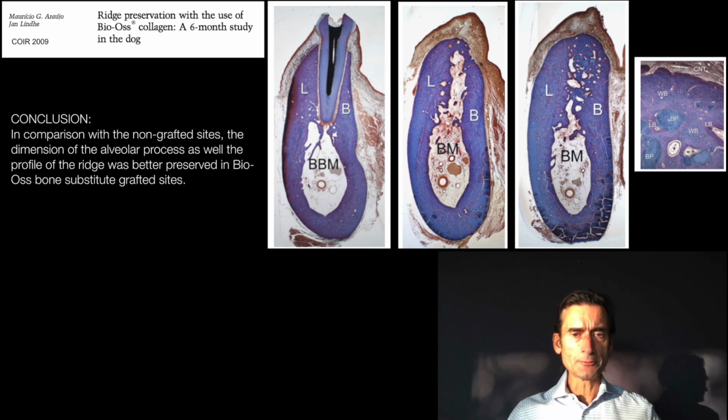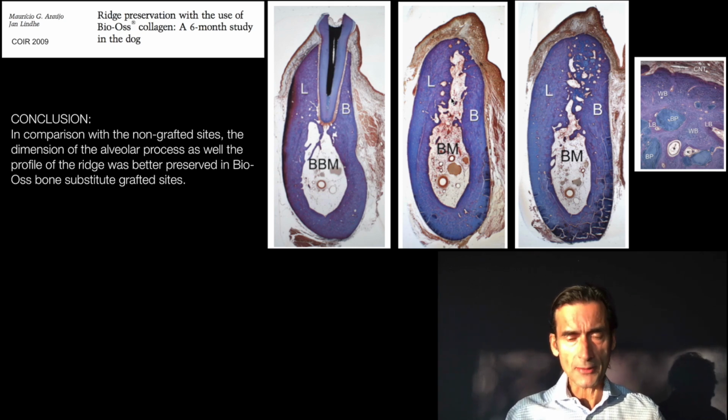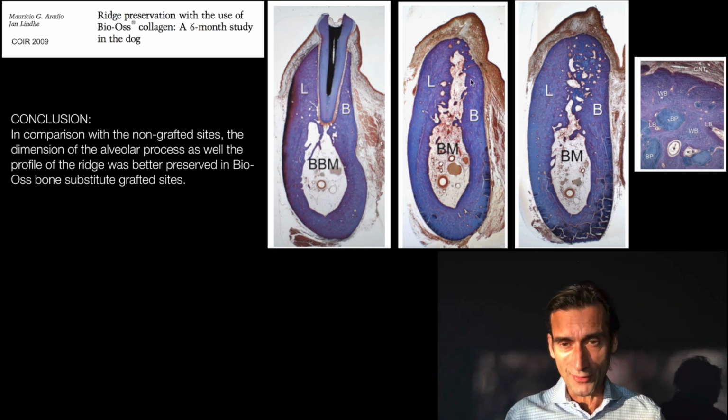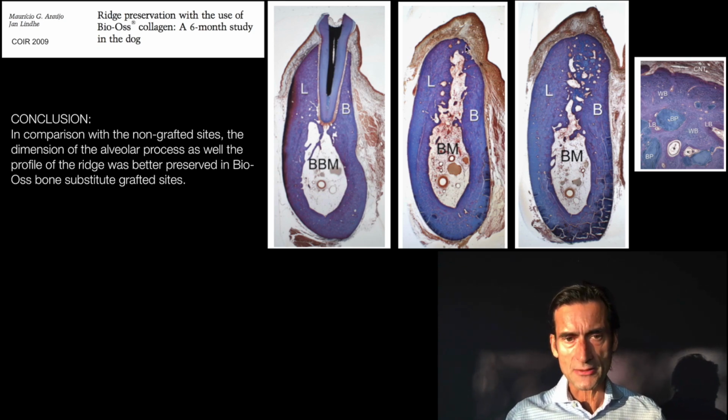And what you can see here on the facial is as soon as this bone on the facial is evaluated carefully, and just look at the buccal bone versus the lingual bone, how thin this is. This is about that 1 millimeter. So when you remove this tooth and root carefully so that you don't break that buccal bone, you're placing an implant, as you can see here. Sorry, you're not placing an implant. You're actually not doing anything. You just let the bone heal and the soft tissue close. You can see how you get this collapse.